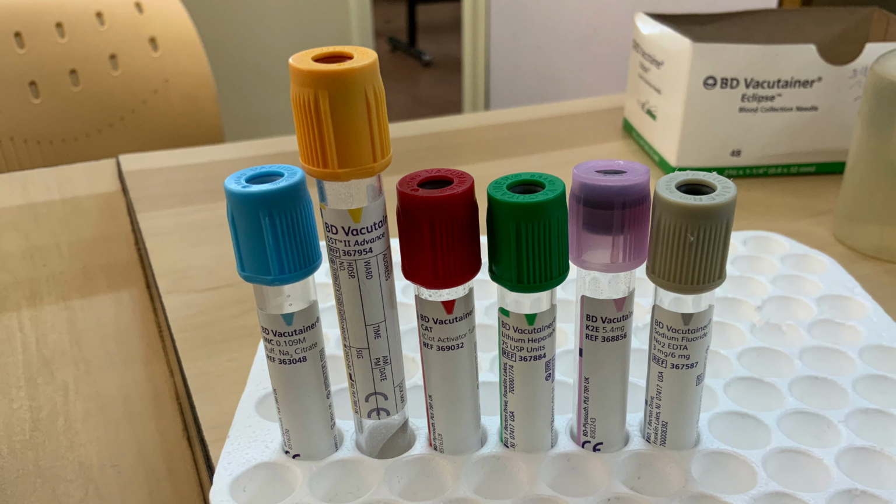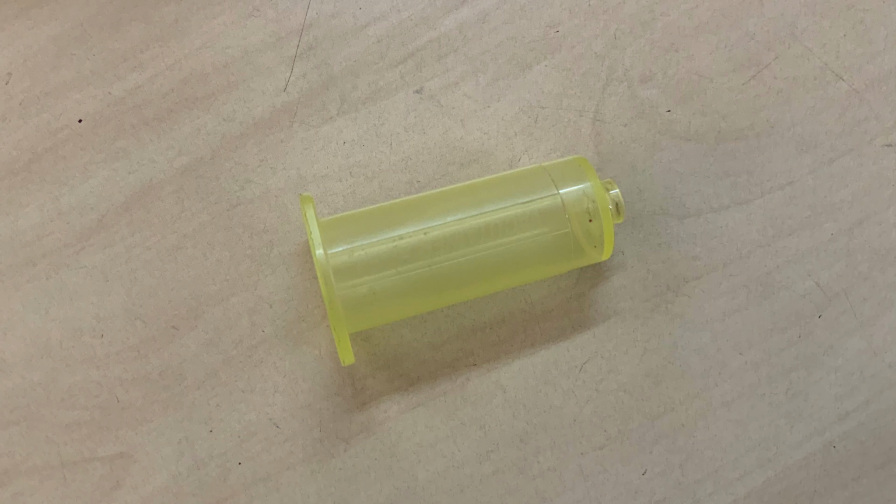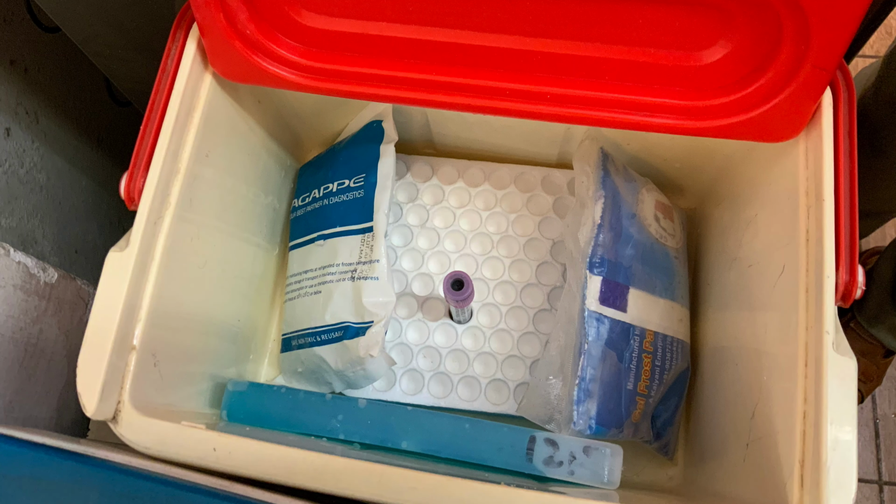Vacutainers in their order of draw from left to right. A new sterile vacutainer needle. A vacutainer holder. Samples which need special care are transported to the lab in ice boxes.